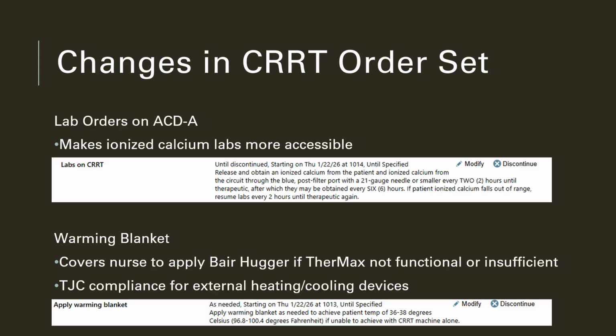We also have a new order that says apply warming blanket as needed to maintain euthermia. This is because nurses cannot apply Bair Huggers without a physician order, so this is checked by default in the order set.